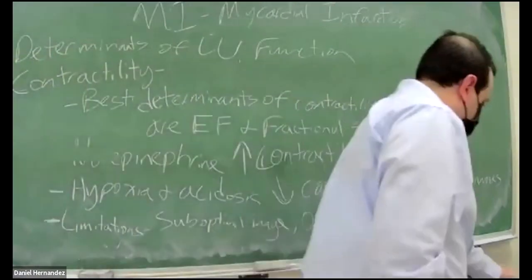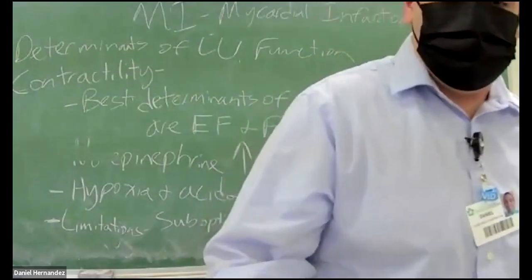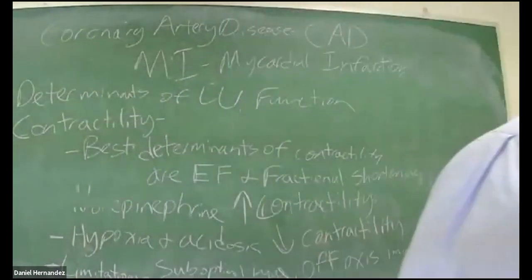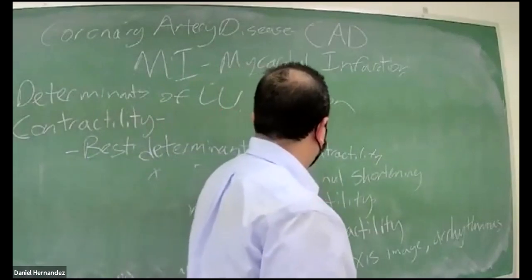Let me see if I can get a good image of fractional shortening. Actually, I uploaded a bunch of clips for eyeballing EF for you this week to go through. See if I can get a good video for fractional shortening.